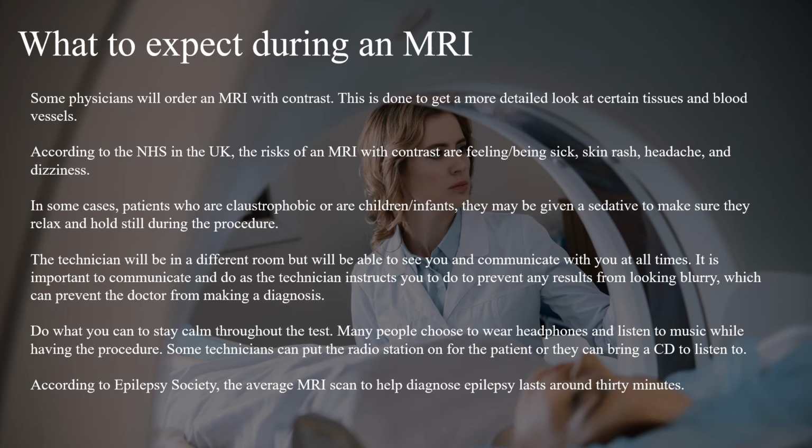Many people choose to wear headphones and listen to music while having the procedure. Some technicians can put the radio station on for the patient, or they can bring a CD to listen to. According to Epilepsy Society, the average MRI scan to help diagnose epilepsy lasts around 30 minutes.